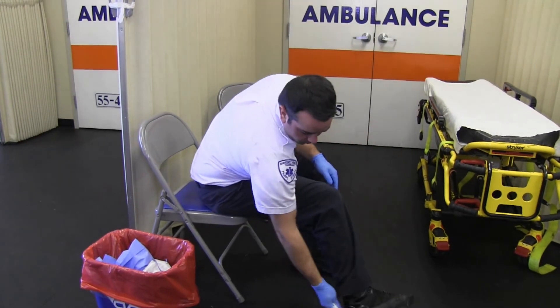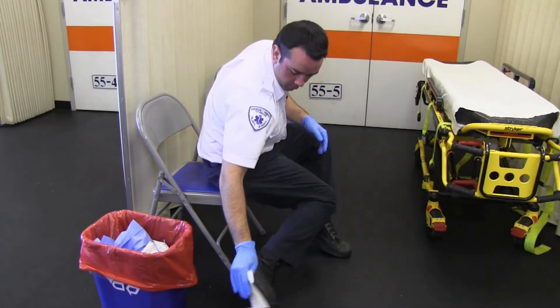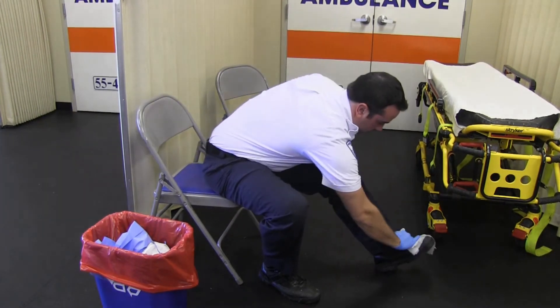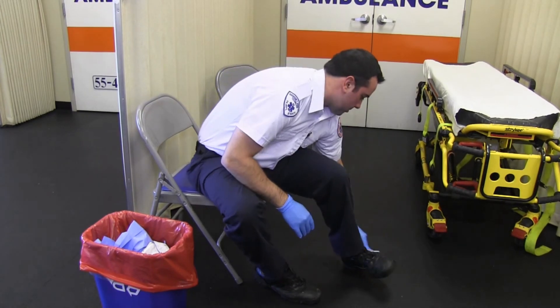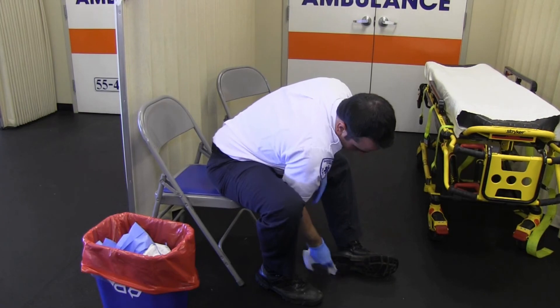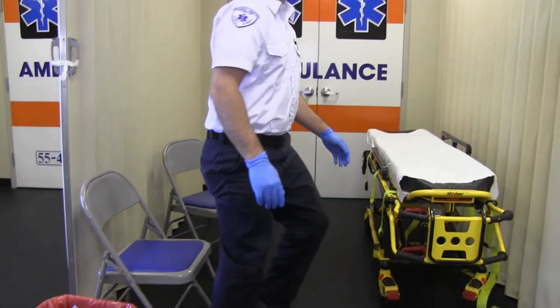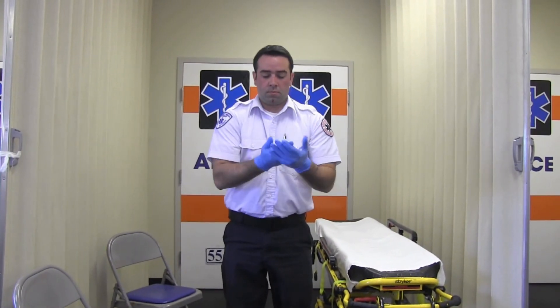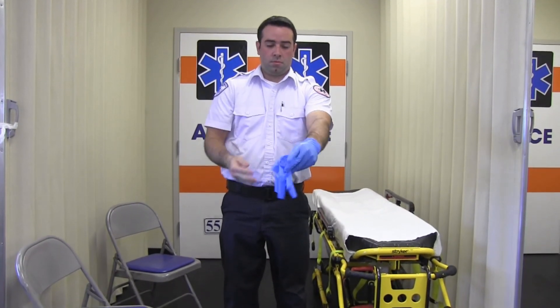Now you will disinfect your boots. Sitting on a new, clean surface, use an EPA-registered disinfectant wipe to wipe down every external surface of your boots. Now you will disinfect your gloved hands with an alcohol-based hand rub. Remove and discard your gloves, taking care not to contaminate your bare hands during the removal process.